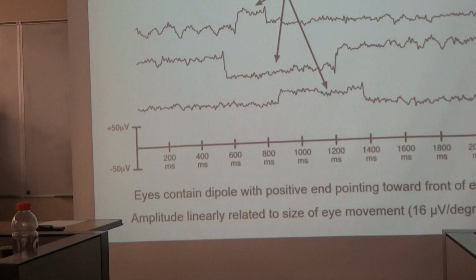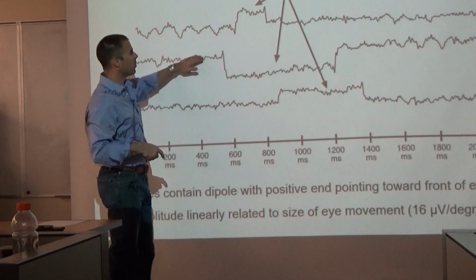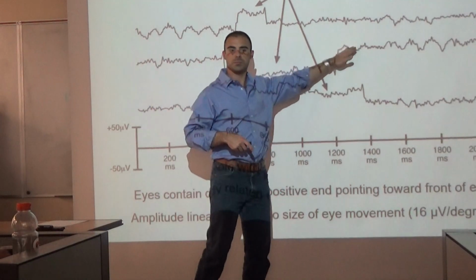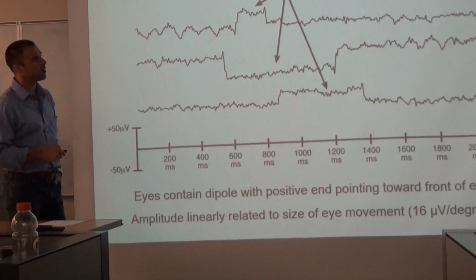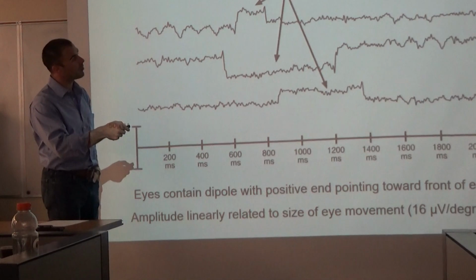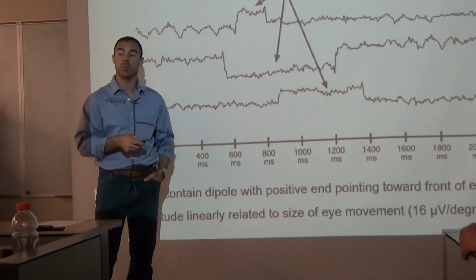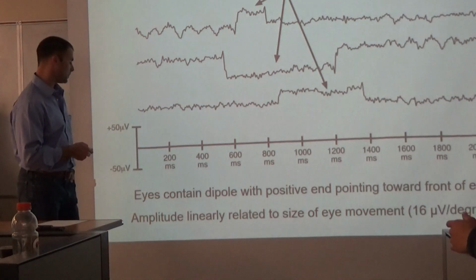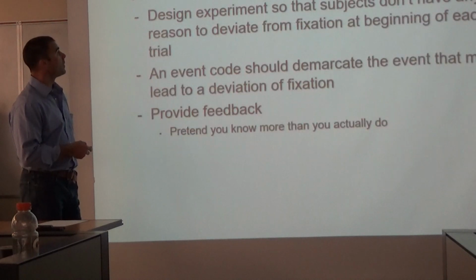We've introduced this idea of saccades already, right? Where you have the electrical activity moving along, and then you have that eye movement left or right. It's some examples of what that might look like. Okay? And you remember when we were drawing it earlier today, we put that little L or the R there to indicate the left or the right side that it was recording from. So we have that as some artifacts on the horizontal direction.